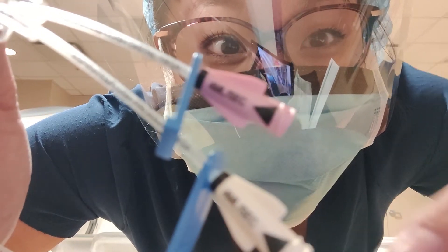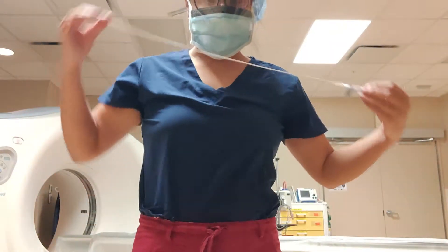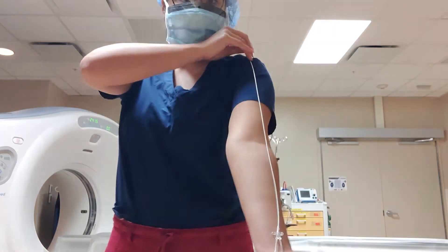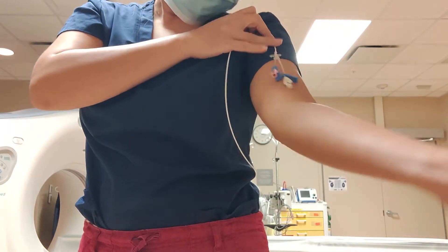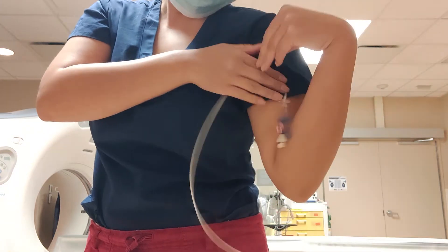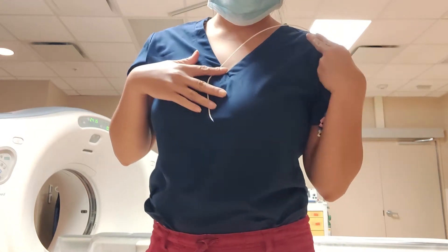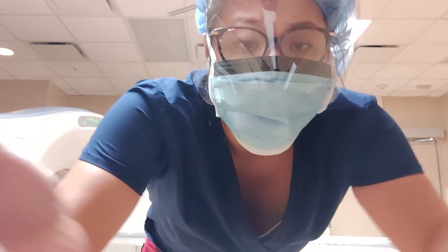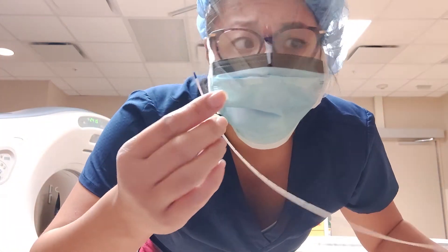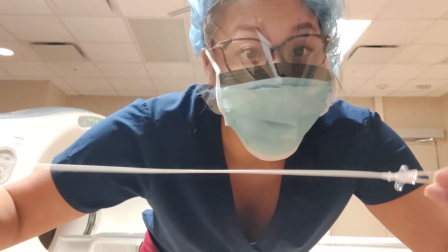Hey y'all, look what I have here. This is a PICC line — it's very neat. I've never seen the internal part of a PICC line before. Look at how long this is; it's almost as long as my arm. Normally you would see it on someone's arm — it'll stick out, this external portion — but then they snake this through and it'll come to your heart.